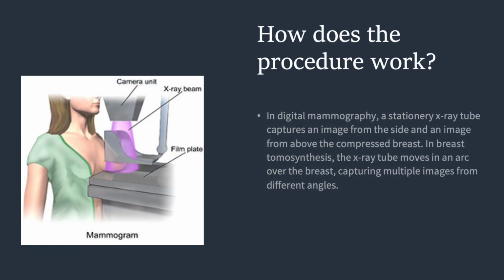So now, how does the procedure work? Well, X-rays are a form of radiation like light or radio waves. X-rays pass through most objects, including the body.